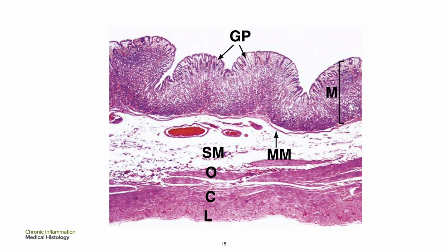The muscularis propria comprises the inner circular, C, and outer longitudinal, letter L, layers, but the inner circular layer is reinforced by a further inner oblique layer, letter O. The submucosa, SM, is relatively loose and distensible, as you've seen here, and contains larger blood vessels. The serosal layer, which covers the peritoneal surface, is thin and barely visible at this magnification.